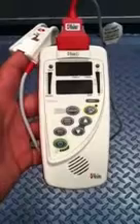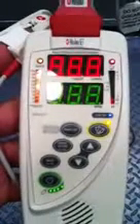This is the Massimo Rad 57 CO Oximeter and Pulse Oximeter. Simple operation: press the green button, let it come on and do its self-checks. It will go through a number of screens.